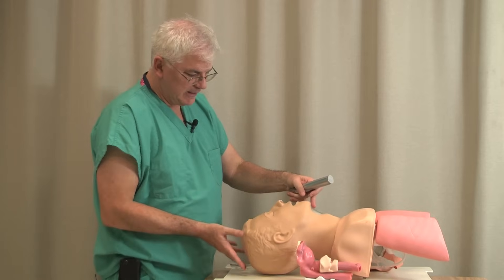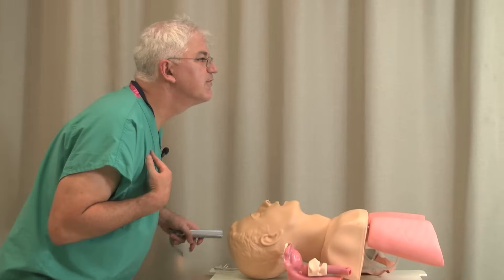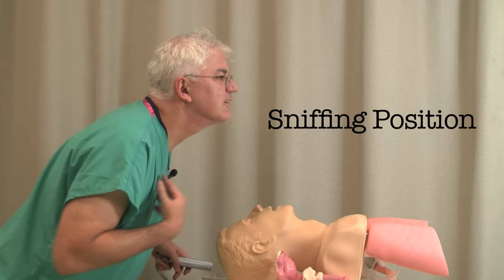Head position is key — you really want to get the patient in a sniffing position. The idea is to range their head as much as possible so you have the straightest possible axis into the trachea.